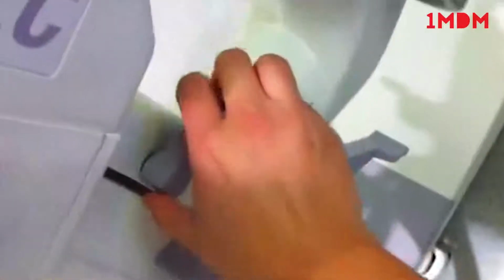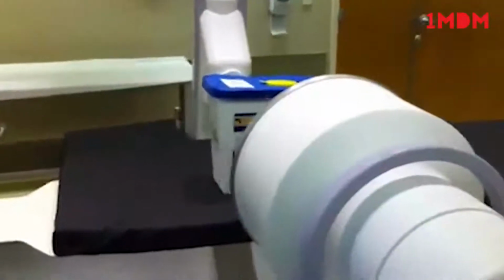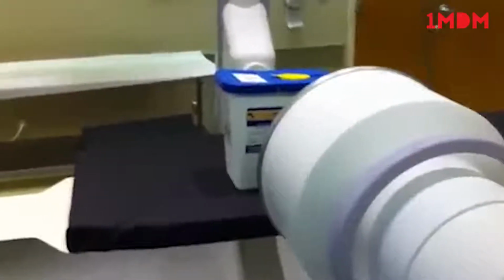Let me go ahead and lock the C-arm here, now that it's in a lateral position. Bear with me, I only have one hand because the other hand's holding the camera here. Okay, and now it's in a lateral position. Oh, it looks like we're not quite centered to the patient there. So I'm going to unlock this now, turn the handle and push it forward a little bit. Right about there. Looks pretty good.